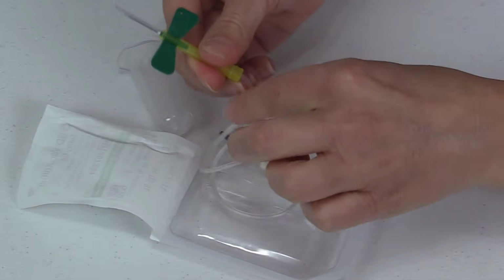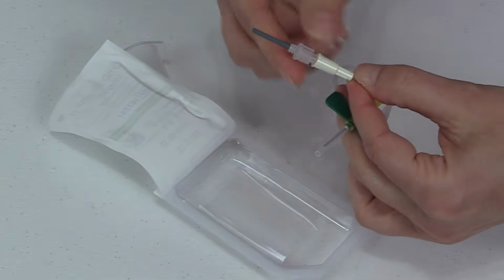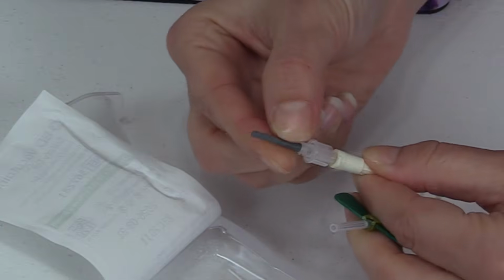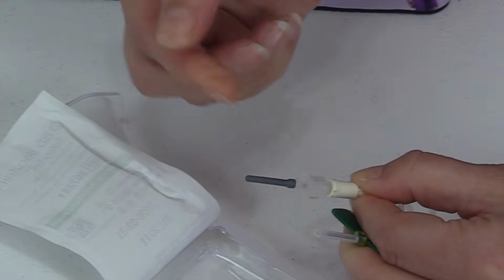This is where the blood is actually going to draw down through. And this part is a gray little rubber stopper, but inside of it, it has a needle. See, right here. And this is what pierces your tube and allows the blood to flow down into it.